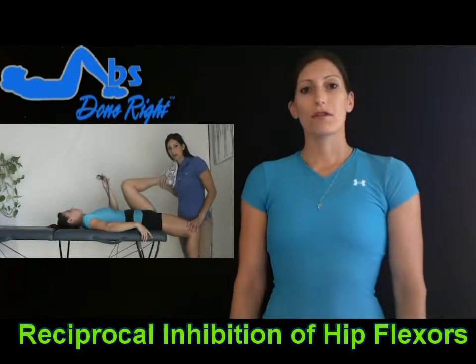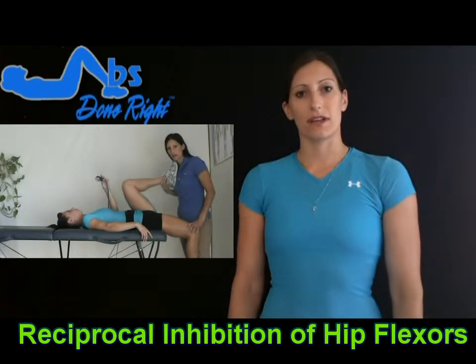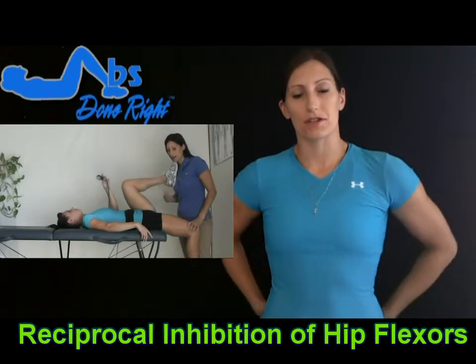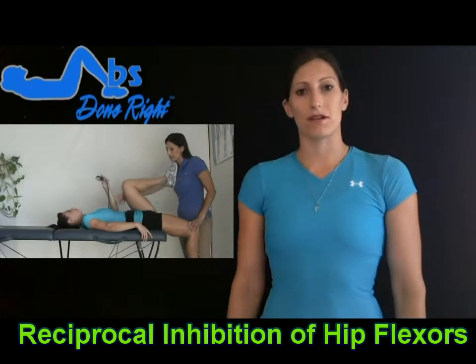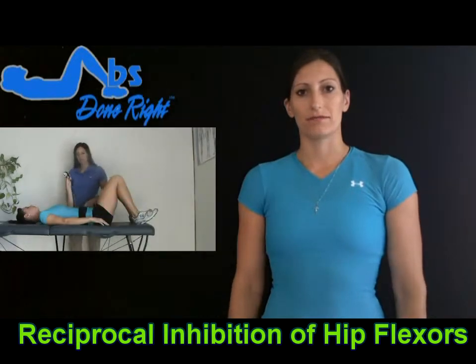abdominis. Fourth, you can increase hip flexor flexibility and hip extension range of motion by activating your core. So you could have your patients do a Thomas stretch, put the belt around their waist and have them maintain green zone, which is neutral spine, while you stretch the hip flexor.